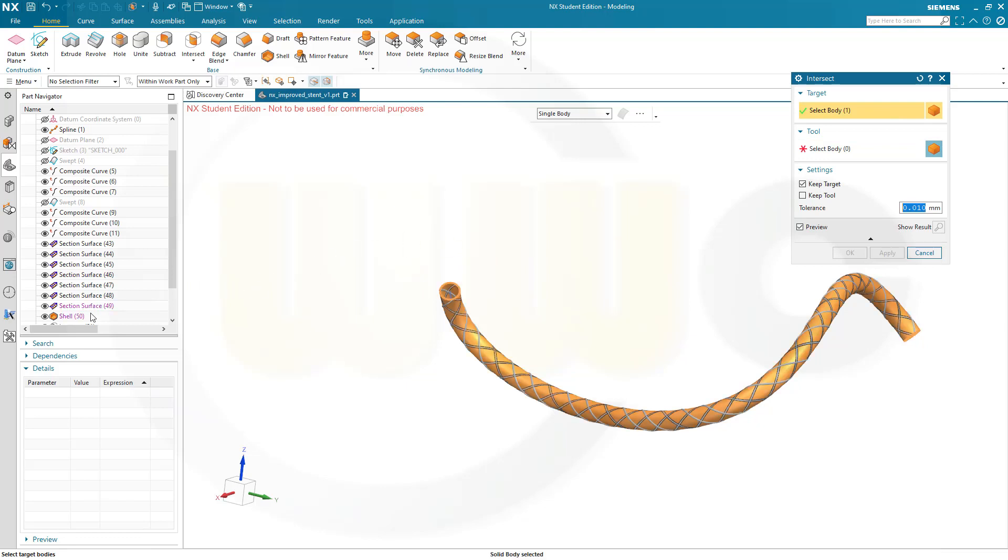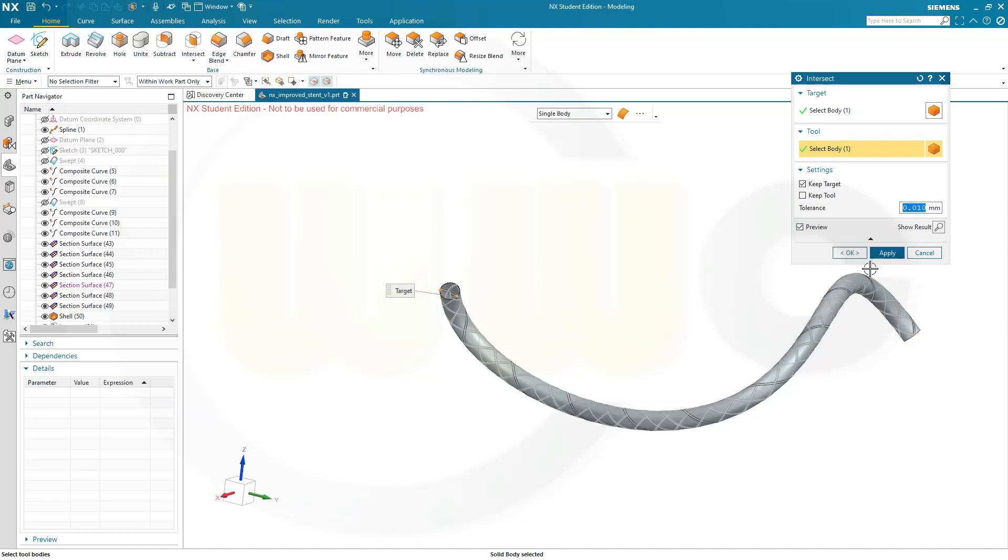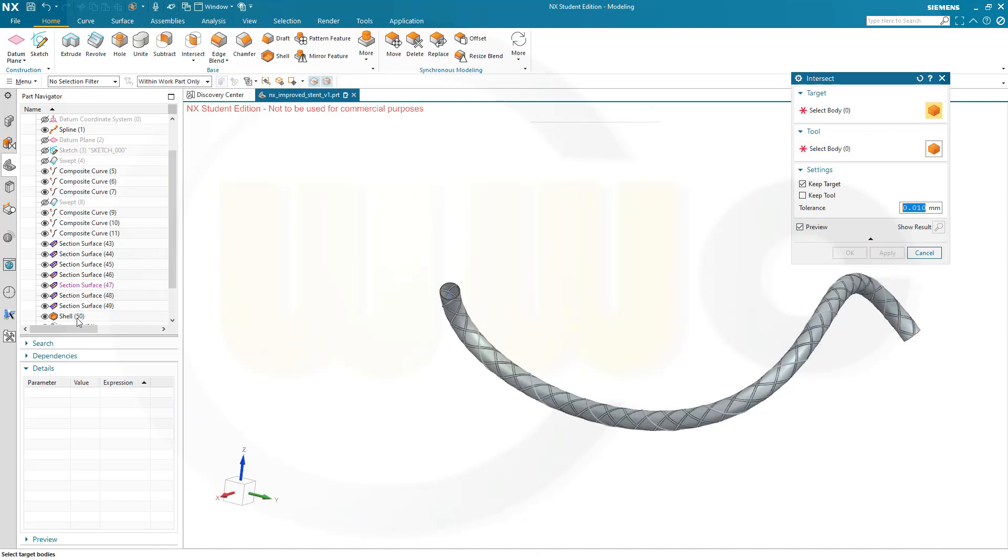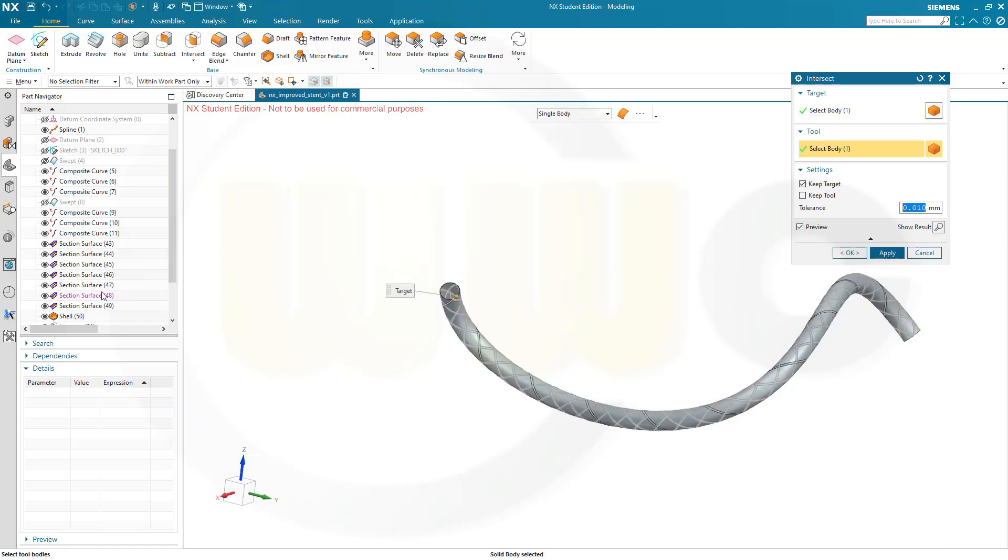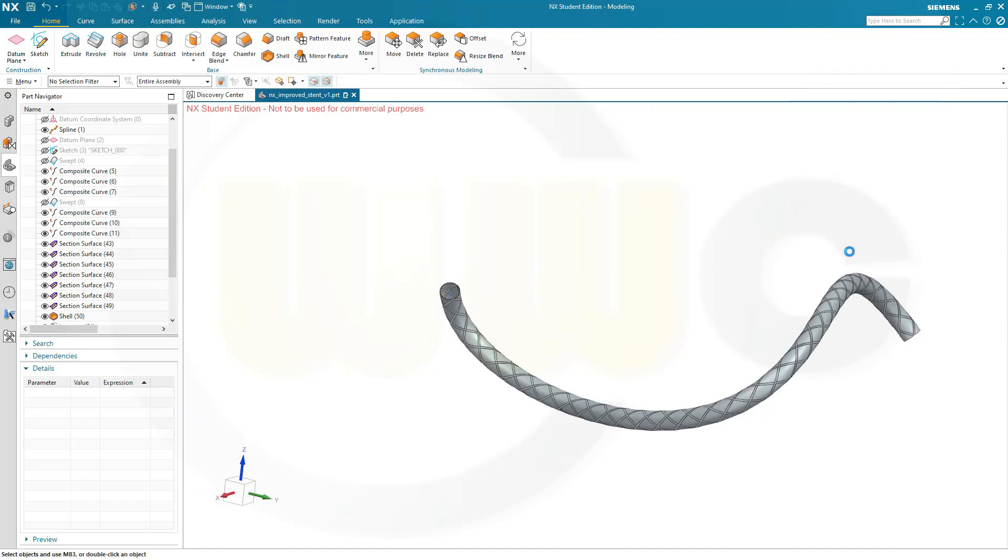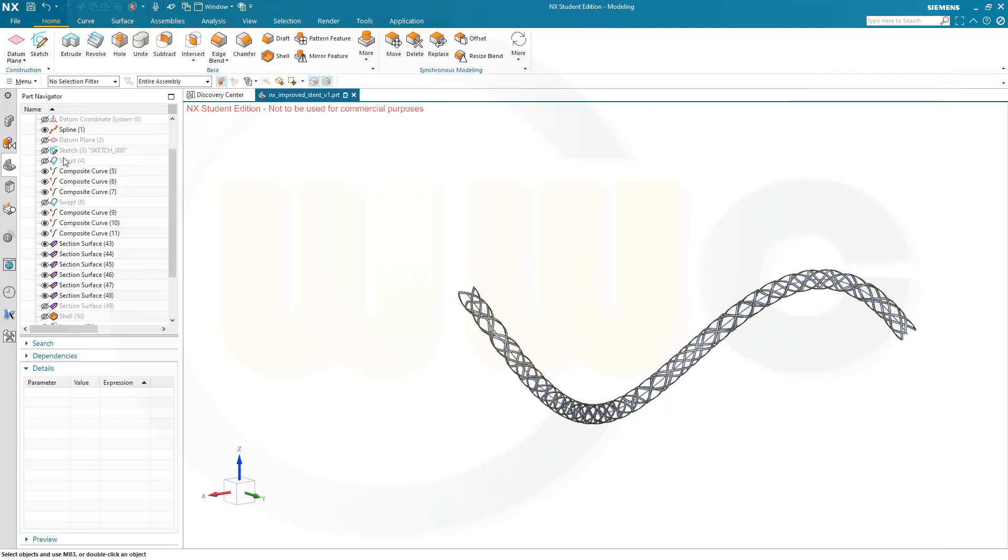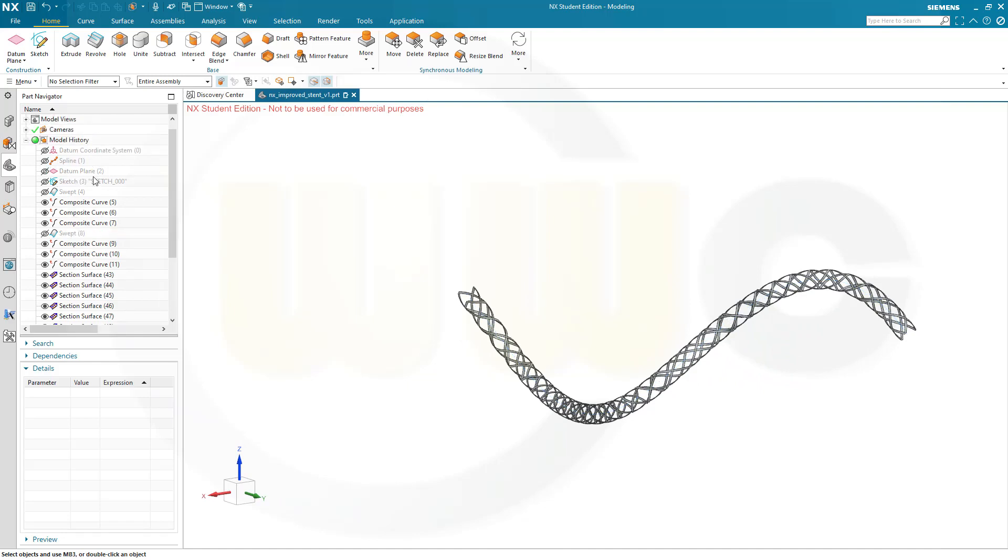Again the shell, now the fifth one, apply. And again the shell solid. And hide that spline.